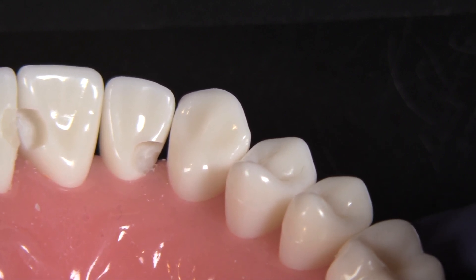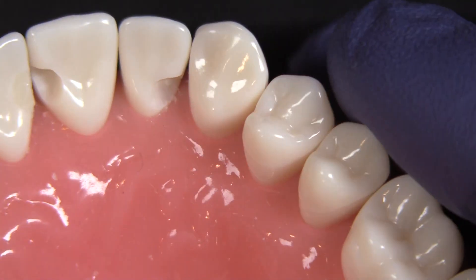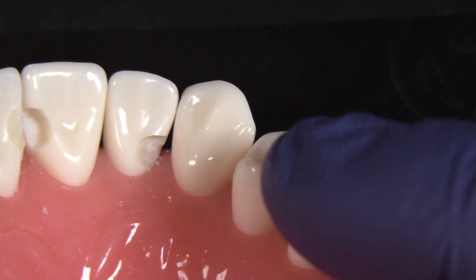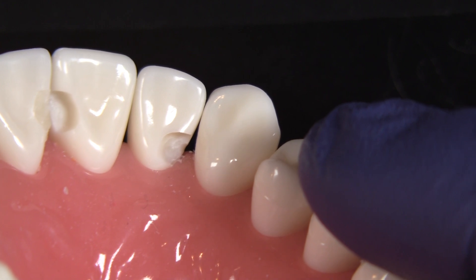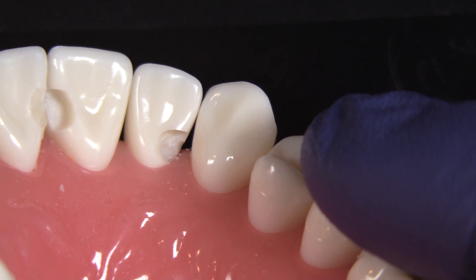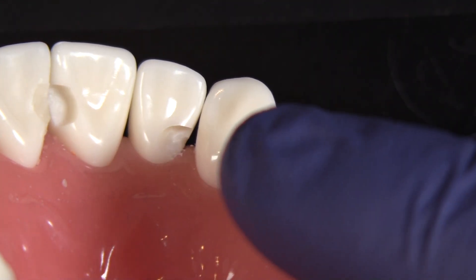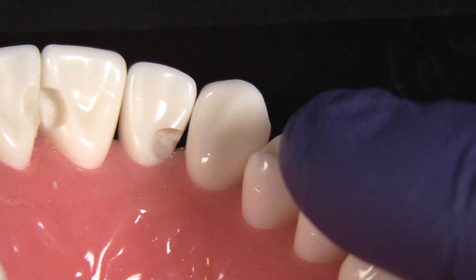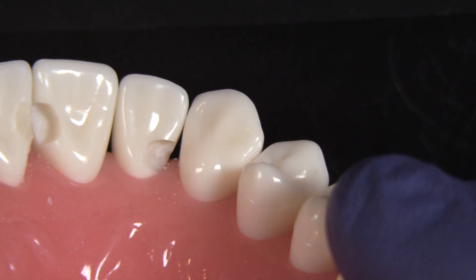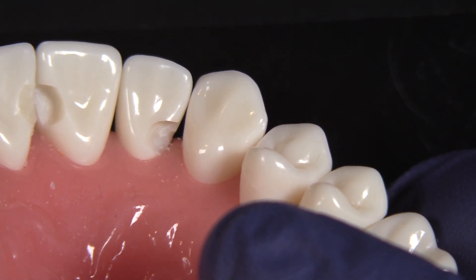You worry about that seal of the margin there. Would you ever use a diode laser and trim some of the tissue back? Yes. If you have a laser, that works really well. For something like this, I use a totally smooth burr — it has no diamonds, no cutting surface at all, just a smooth barrel. When you run that at a really high RPM with no water around that gum tissue, it essentially cauterizes the gum tissue. The reason I like that is because I don't have to mess with another instrument or a laser. For something like this, where I just want to get rid of a little tissue and stop the bleeding to make sure I get a good restoration, that's typically what I'll use.